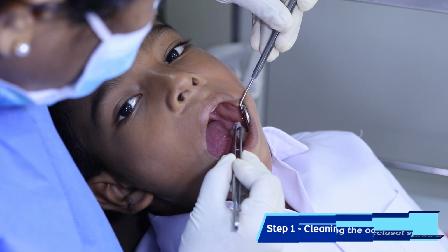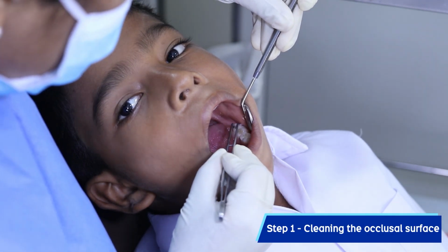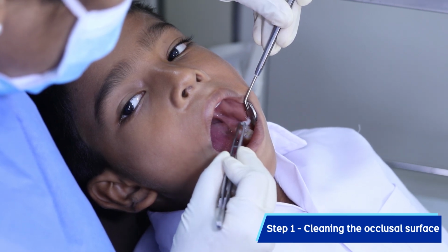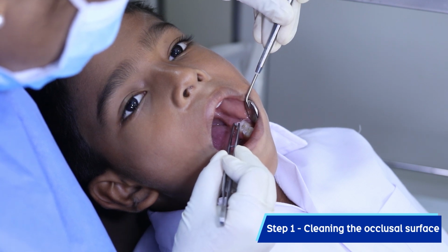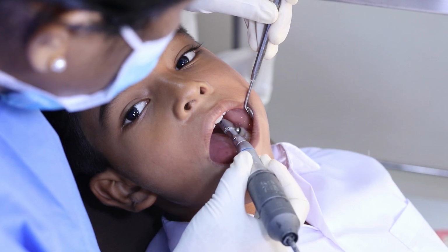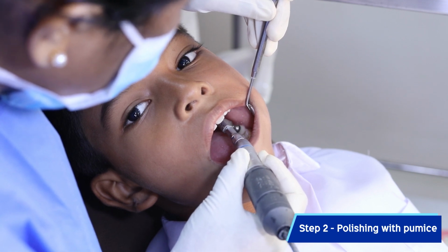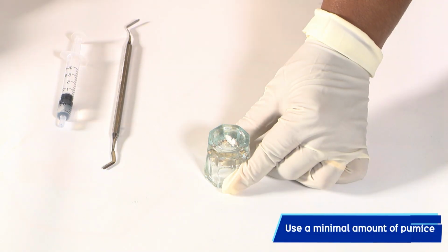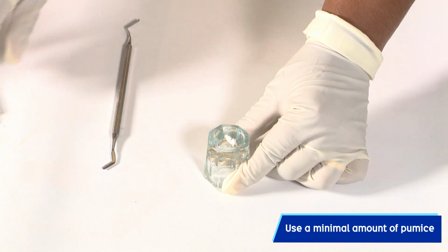All food debris should be removed from the occlusal surface with a moist cotton pellet. If there is gross debris, such as calculus, refer the child to the nearest government dental clinic. Polish the occlusal surface using pumice applied with a polishing brush in a micromotor handpiece. Use a minimal required amount of pumice.